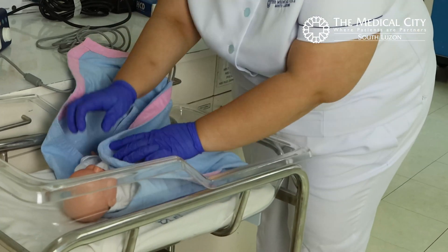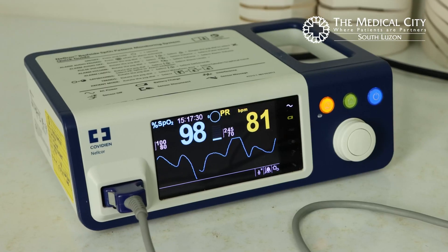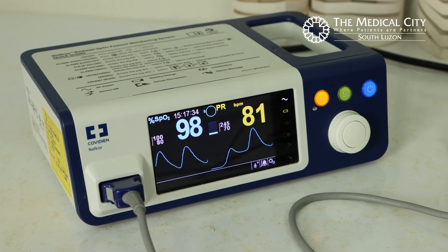Swaddle and calm the patient. Check the oxygen saturation number on the monitor. These are the post-ductal readings.